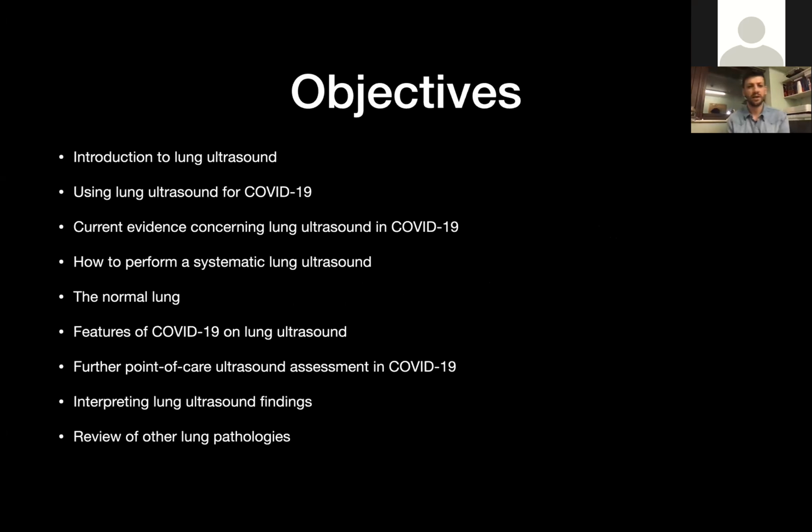And I thought maybe towards the end, or maybe you could even butt in while we're going along, but Anna and Michael might be able to give you their take on how they're using lung ultrasound in their departments. And then we'll talk a little bit about how we're actually going to do this lung ultrasound, how normal lung will appear, and then some of the features of COVID, and then how we're going to differentiate that from some of the other things that we used to look for before all we're seeing is COVID.